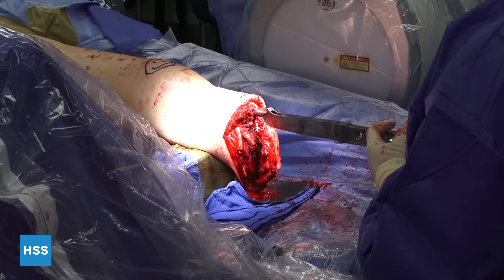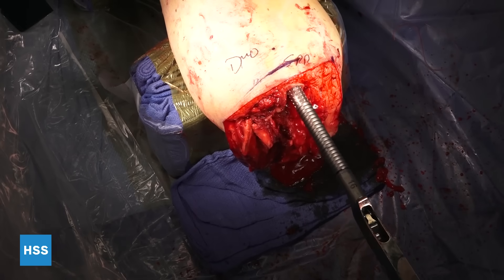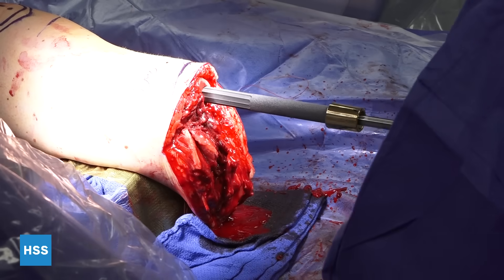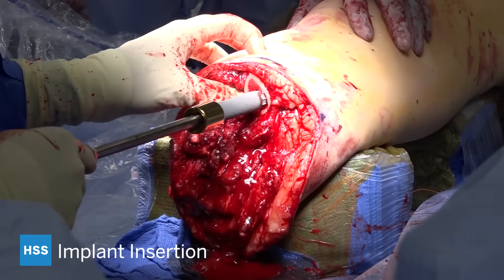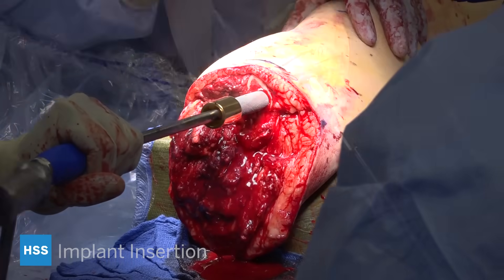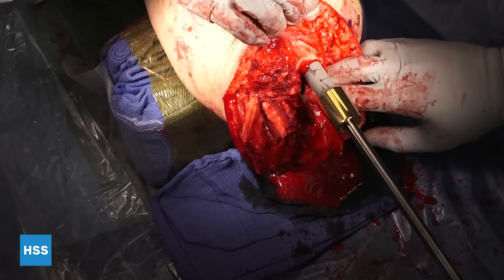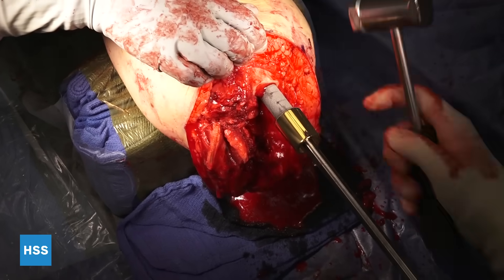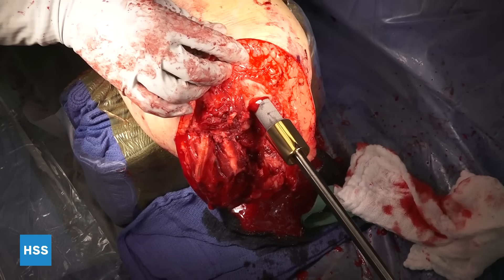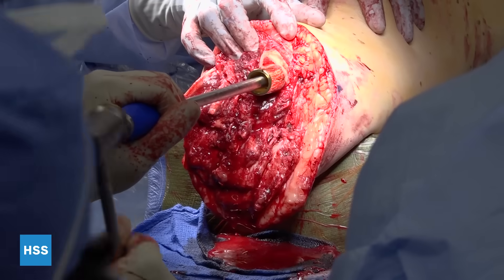The implant has a slightly tighter fit than the last rasp used. Here you can see the 16mm rasp going in — it should have a certain amount of resistance. This is the implant; it's a porous-coated titanium implant. Usually you can insert about half of the implant immediately, and then the rest of it takes some gentle yet firm impaction. You need to see progress while you're doing it, so I mark it with lines to make sure I'm getting the kind of resistance and feel that is appropriate.